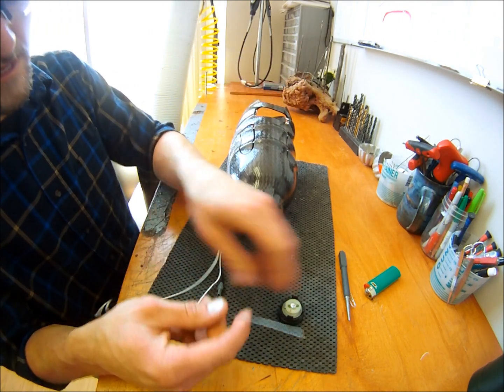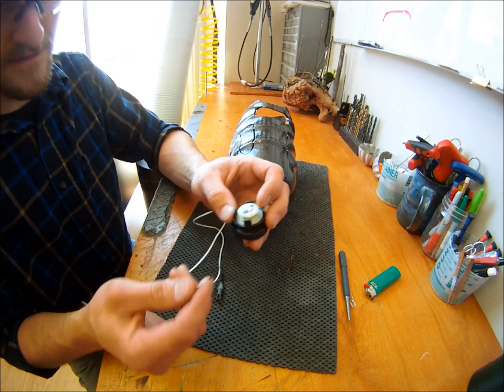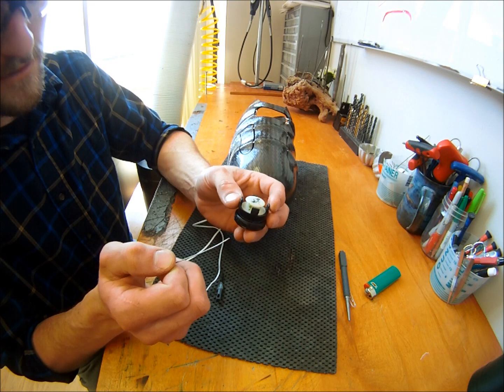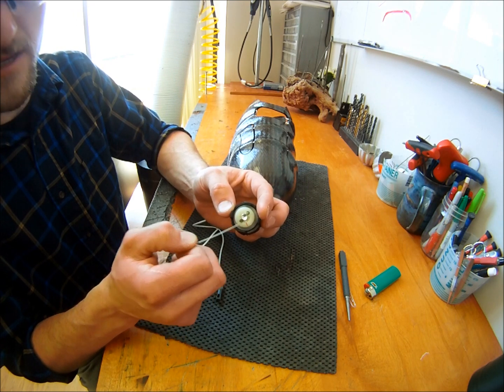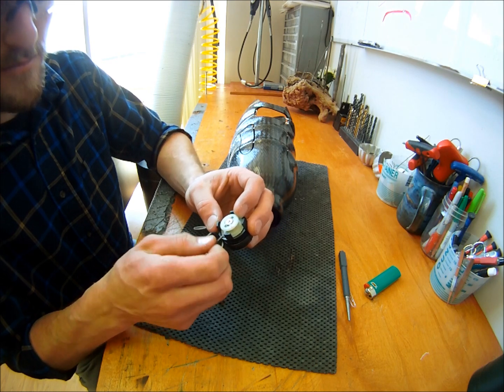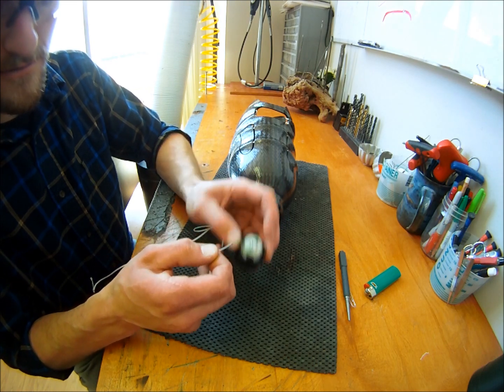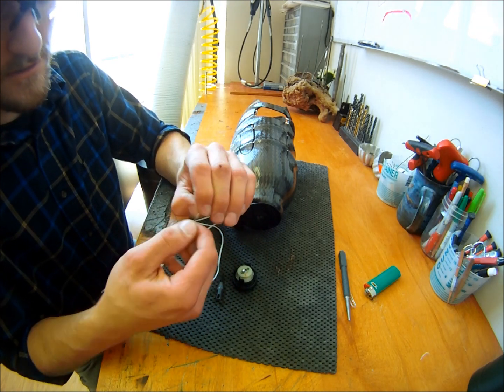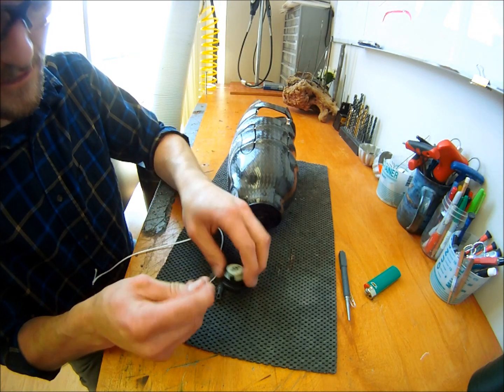And we come to lacing the string into the spool. You want to start with this green hole on the side of the spool. It's going to exit out the base, also marked green. It may be helpful, if you can't get the thing through, to put a small bend on the end of your feeder. You can use a pair of pliers or something similar to do that.